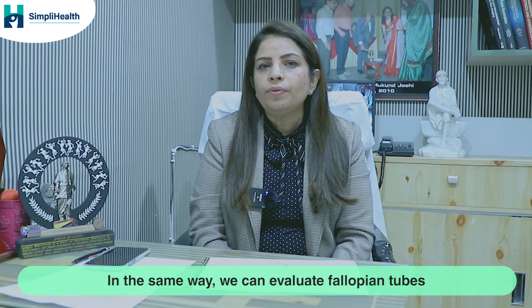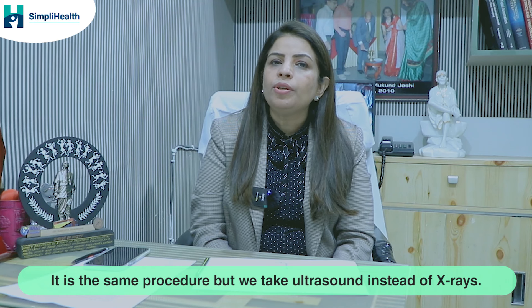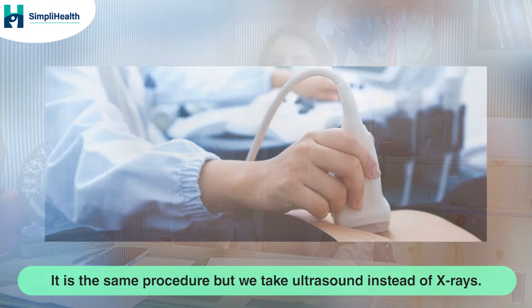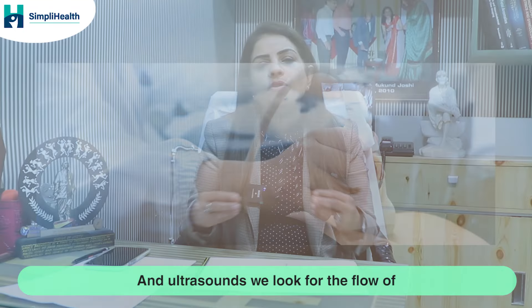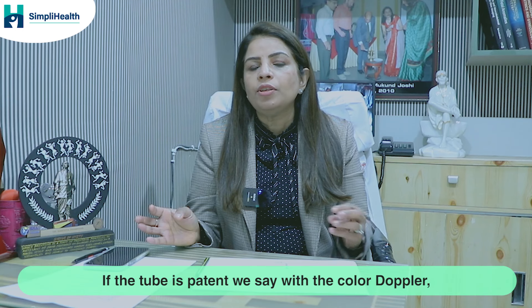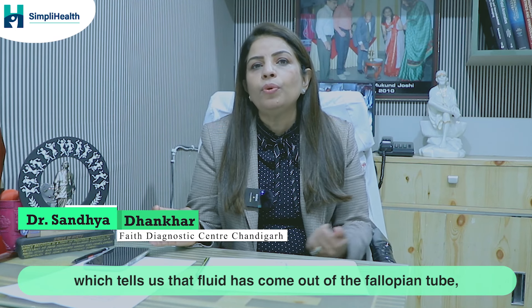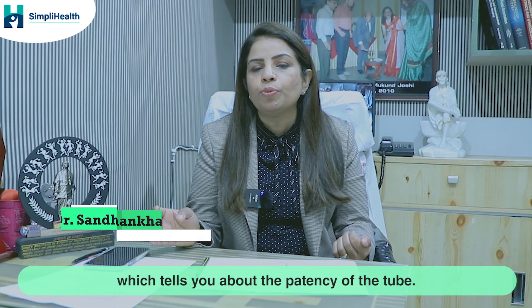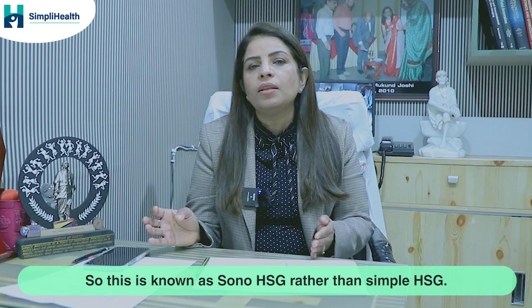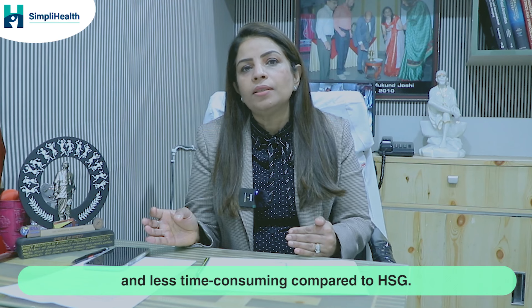We can also evaluate fallopian tubes using ultrasound — the same procedure but with ultrasound instead of x-rays. We look for the flow of saline in the fallopian tubes and adnexa. If the tube is patent, we see with color Doppler a cascade of color flow in the adnexa, confirming that fluid has passed through the fallopian tube. This is known as SonoHSG, which is less painful and less time-consuming than standard HSG.